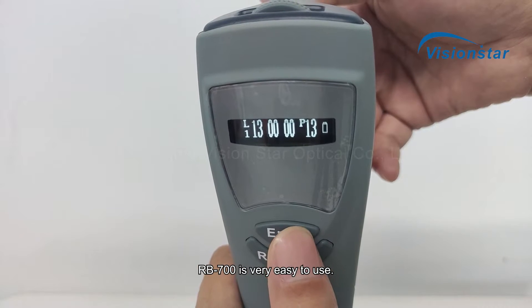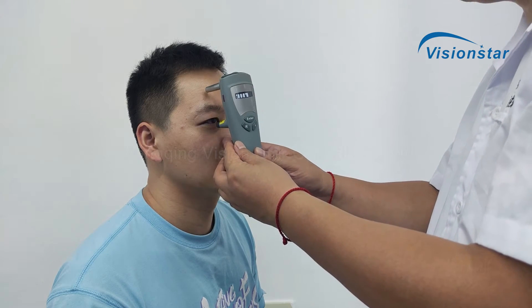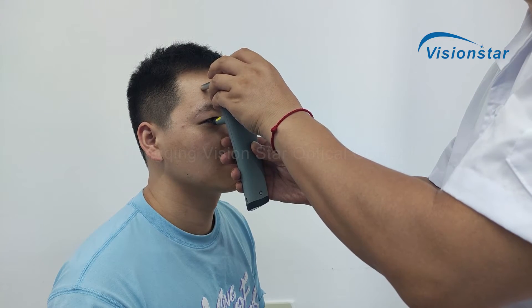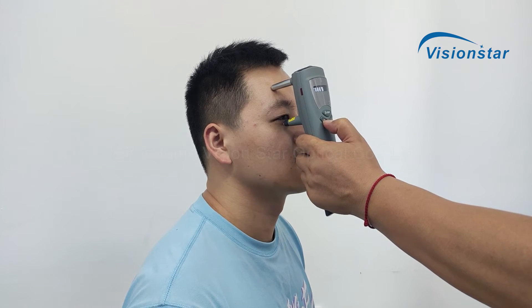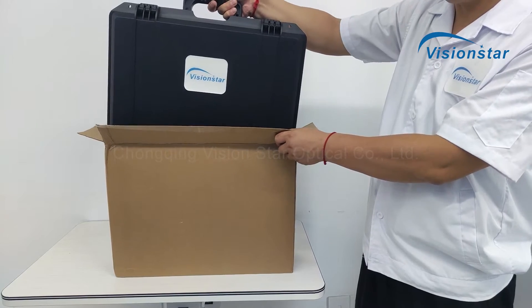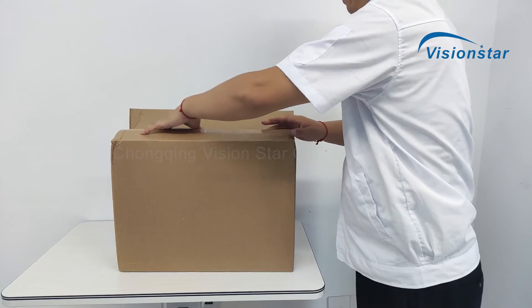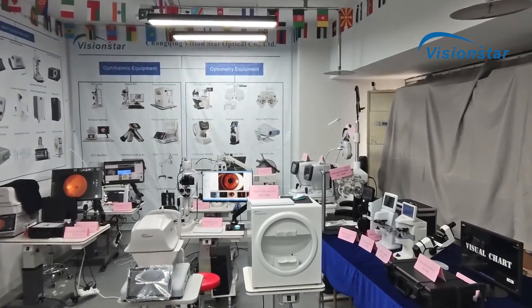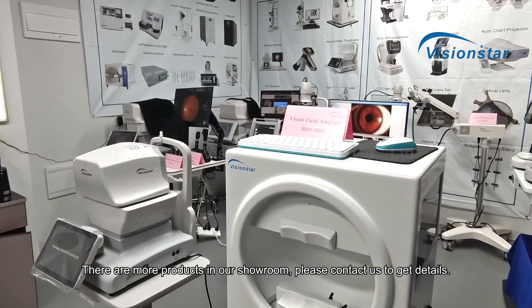The RB700 is very easy to use. Let's see the demo test process. Please contact us to get details.